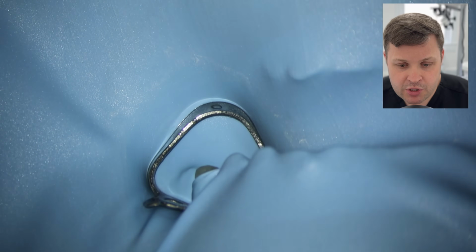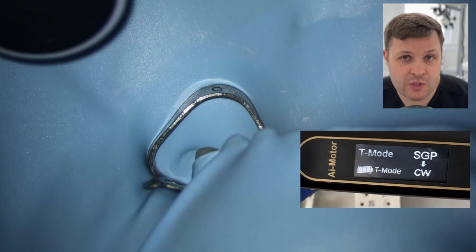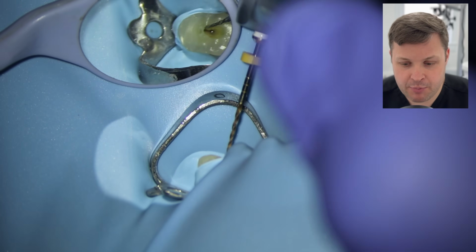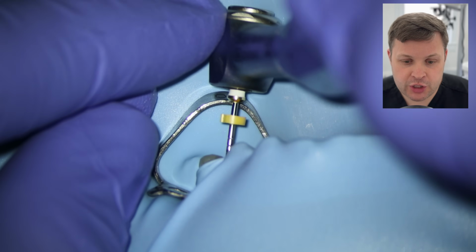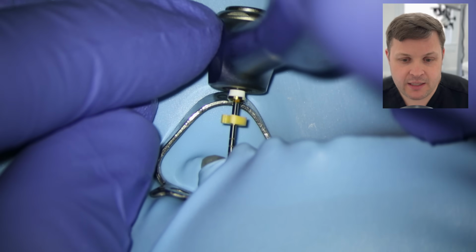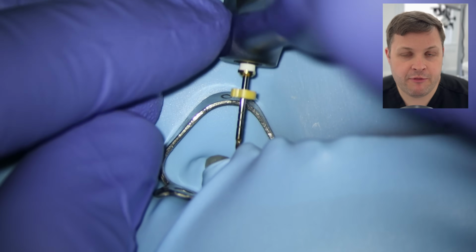ledge. But what I am going to do here is try and use this glide path file in T mode, so it's kind of that automatic reciprocation mode. And then when I introduce this 1503 into the buccal canal, you'll notice that it gets a little bit stuck. And again, if I say this once, say 1,000 times, if you're getting stuck on a ledge, don't force the file. You're either going to fracture or you make the ledge worse. Okay, so just really be mindful here.